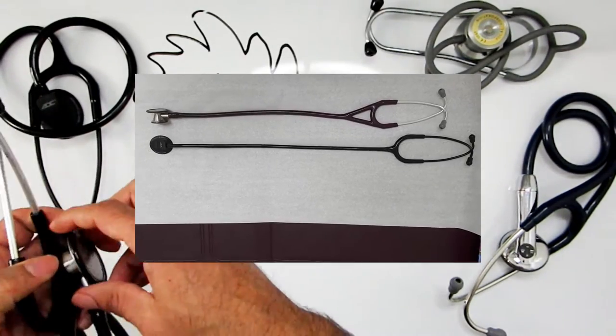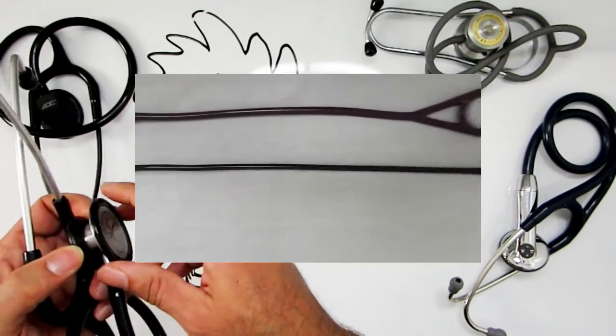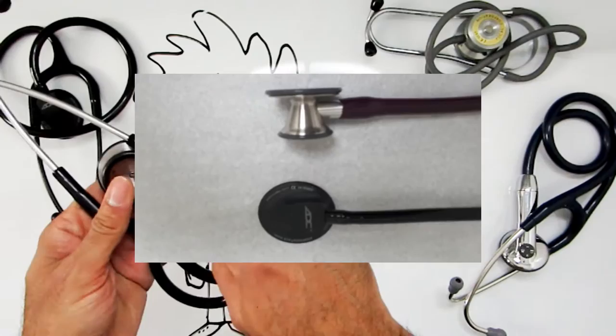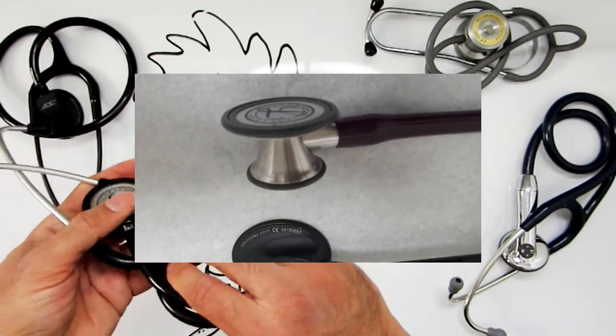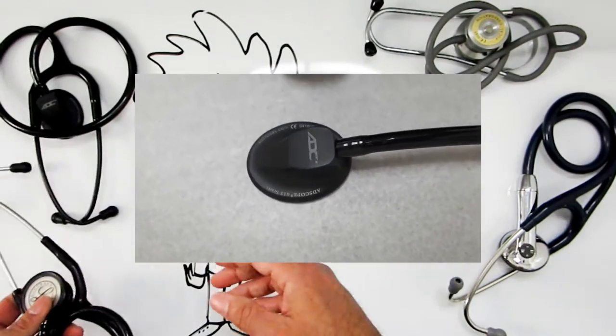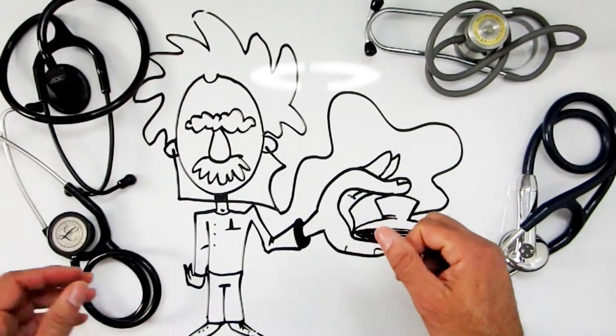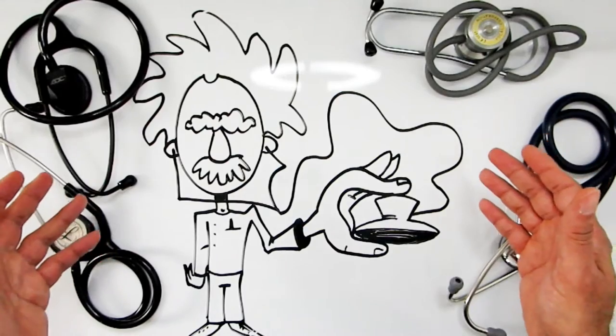A step up from this type, if your hearing isn't that acute, is the cardiology version. The cardiology version, put side to side, has a much larger diaphragm, a much larger bell, and also the conductive tubing is a lot thicker as well. The purpose for that is obviously if you're a cardiologist, you need to hear every little whisper that comes off of a heart.